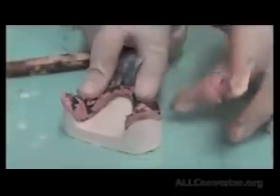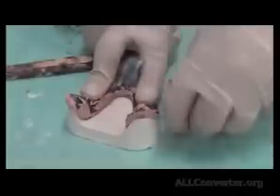And then once we finish, we just keep maintaining the pressure, and once in place, we begin asking the patient to do his border movements. So, for the patient, we say, blow your cheeks, go with the sides of your lips from side to side. We hold the cheek and trim it like this. We also hold the posterior cheek and pull it upwards and trim it.